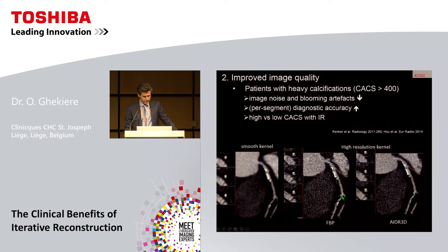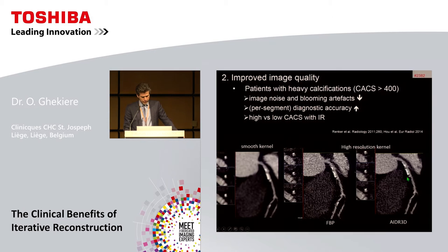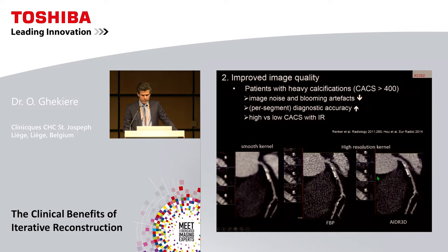Here is a clinical example from my institution of a patient with calcifications at the proximal part of the LAD. Using different reconstruction kernels, you can see blooming artifacts with the smooth kernel. Using a high-resolution kernel with AIDR 3D iterative reconstruction, there is less calcium volume and less image noise compared to the standard filter back projection, with better delineation of vessel contours.